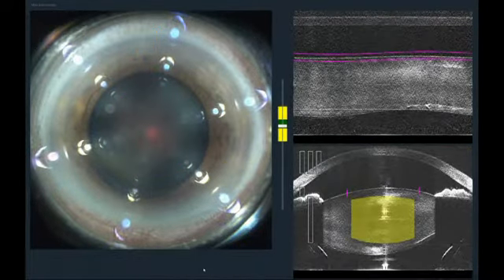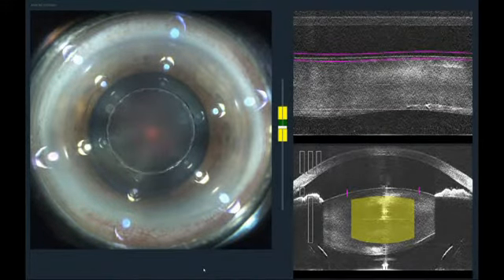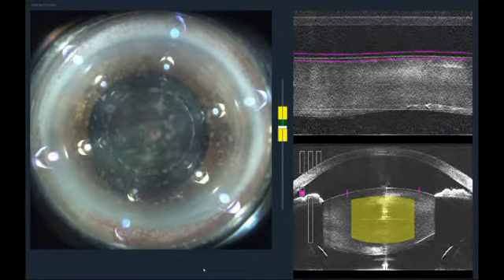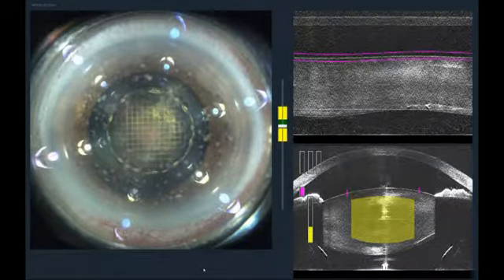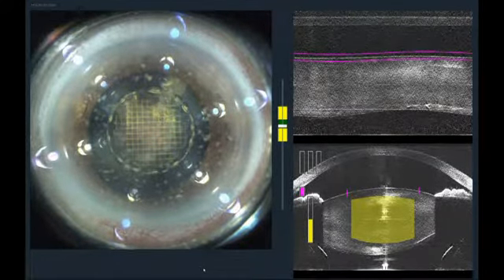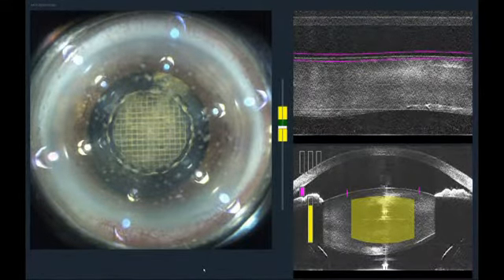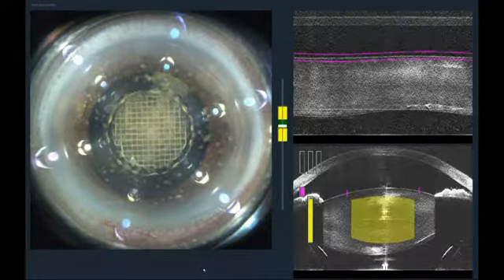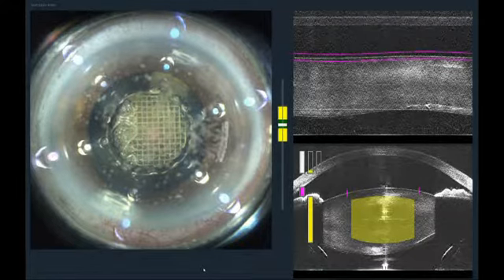You're going to see a little bit of a light show now. The capsulotomy is completed and we're starting in the posterior aspect of the lens. With the matrix pattern we're going to cut it in half to create cubes rather than long rectangles. We've finished the matrix pattern, the arcuate incisions, and now the primary and secondary incisions — and we're done.